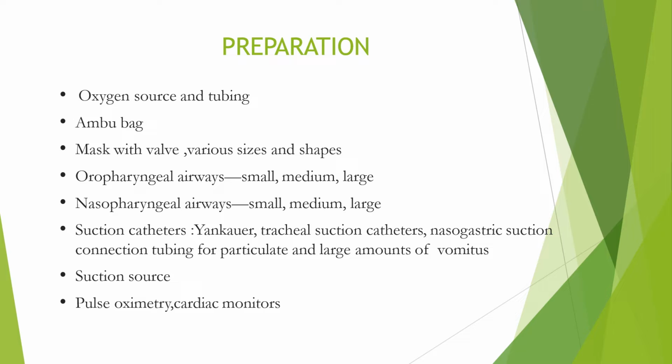Coming to preparation. In the initial phase, the patient is assessed for intubation difficulty and abnormal physiology unless this has already been done, and the intubation is planned, including determining the dosages and sequence of drugs, tube size, and laryngoscope type, blade, and size. Drugs are drawn up and labeled.